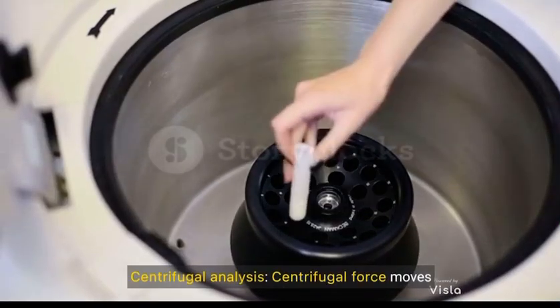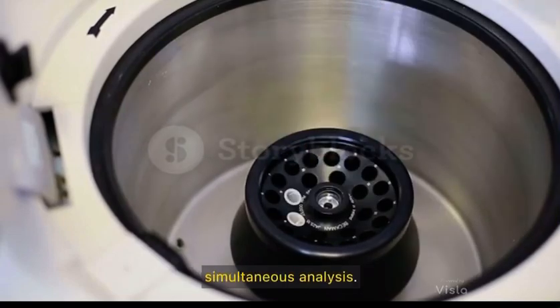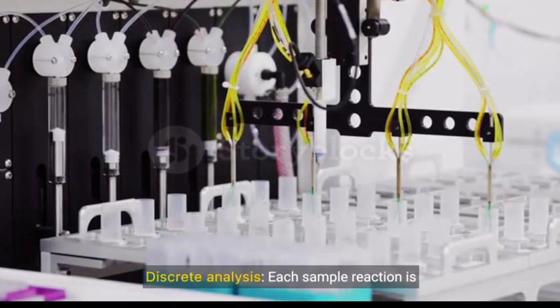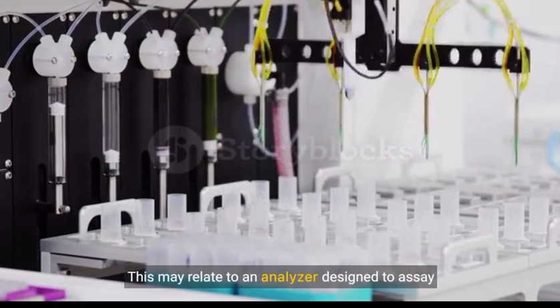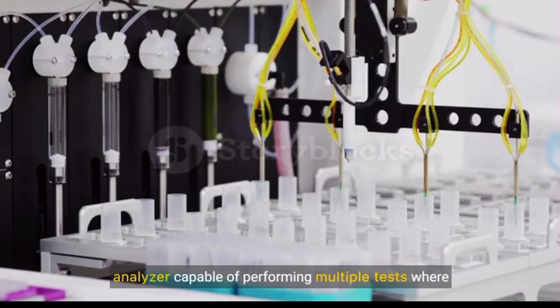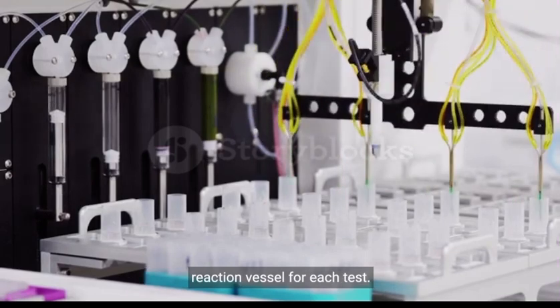Centrifugal analysis. Centrifugal force moves samples and reagents into cuvette areas for simultaneous analysis. Discrete analysis. Each sample reaction is compartmentalized. This may relate to an analyzer designed to assay only one analyte, for example, glucose, or an analyzer capable of performing multiple tests, where the sample and reagents are in a separate cuvette or reaction vessel for each test.